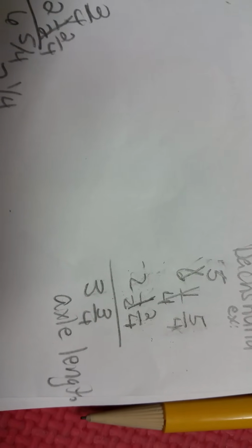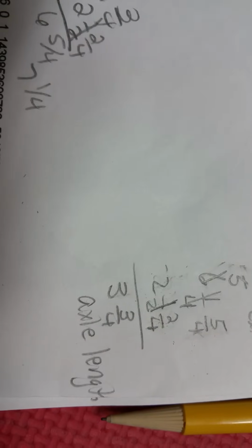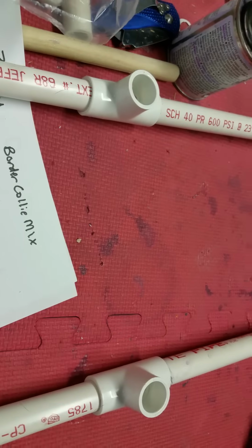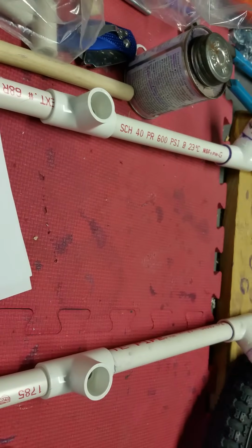If we take that 6 1/4 and we subtract the 2 1/2 of length we already have, we get 3 3/4 inches of axle length that we need. So now we know how long we need to make the leg for a Dachshund cart, just as an example in this short video. Your Dachshund cart also will not need a belly bar. Dachshund cart is just arms and a back and legs.